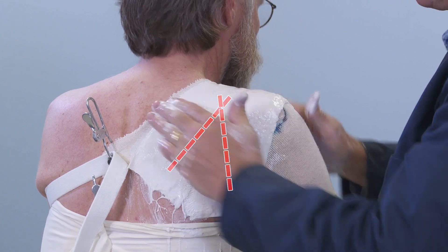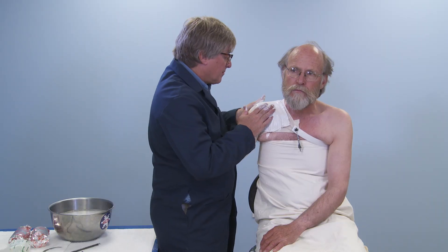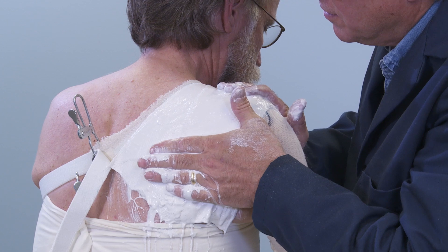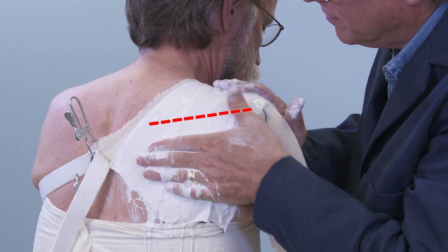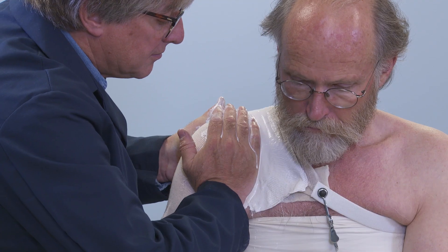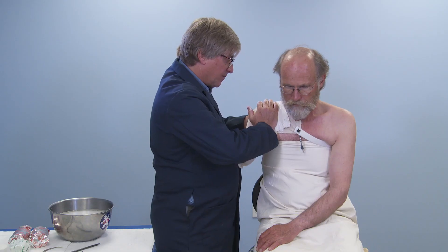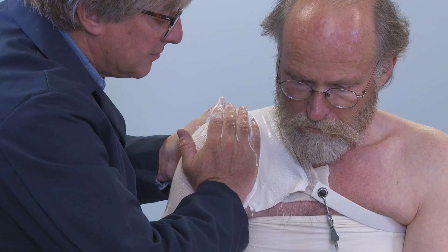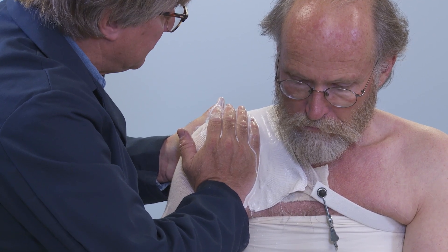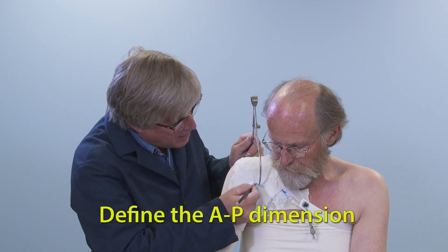Do not extend beyond the pectoralis tendon or the latissimus dorsi. Now mold the AP dimension. The posterior hand placement defines the angle of the spine of the scapula, with the index finger slightly inferior to the spine of the scapula, and the anterior hand placement defines the head of the humerus. Squeeze your hands together to define the AP dimension of the mold. A slight downward pull will minimize superior movement of the splint. Maintain consistent pressure to allow the splints to harden. Outside calipers may be used to define the AP dimension.